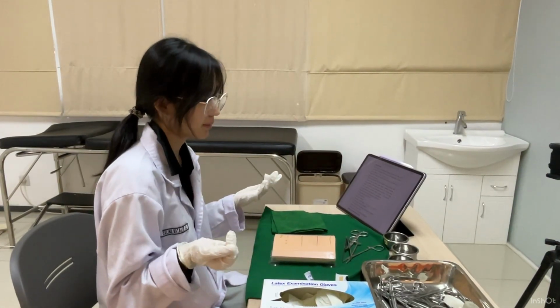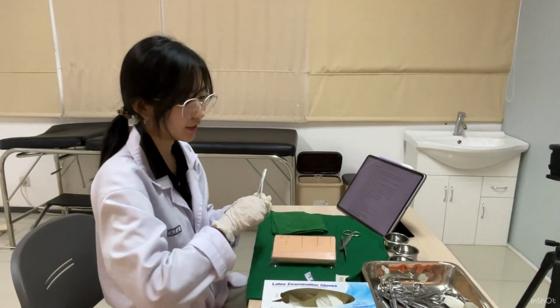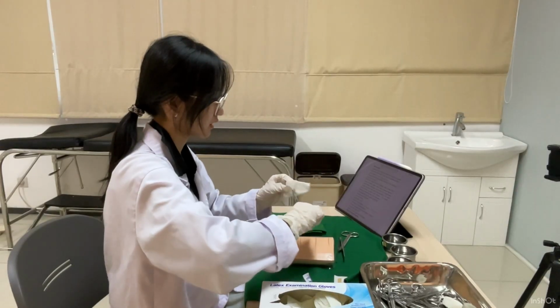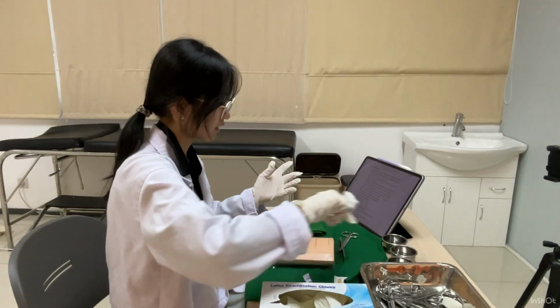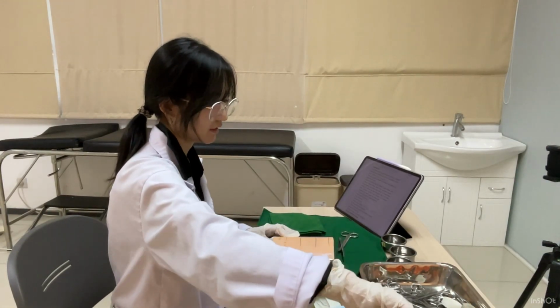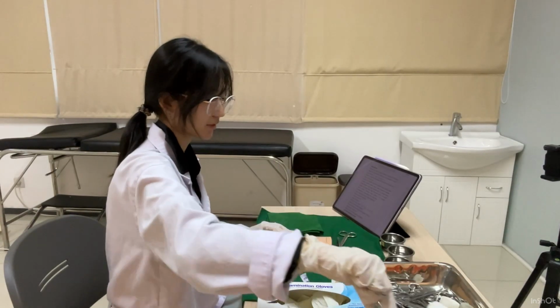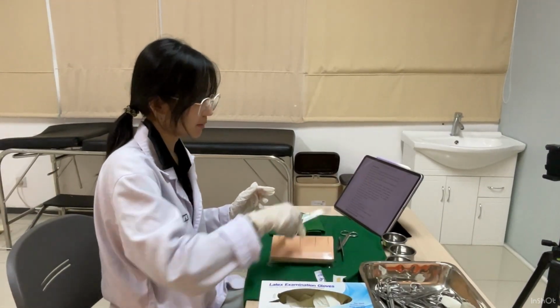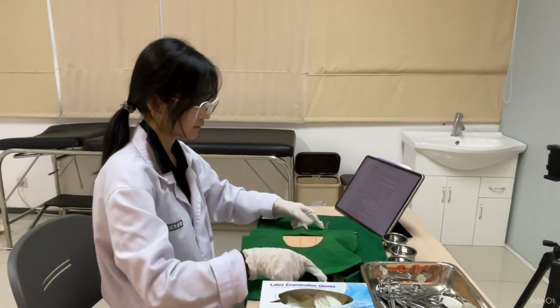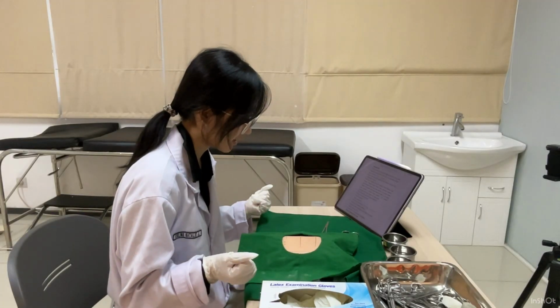And after that, I will perform debridement using the perhydrol, NaCl irrigation, and povidone iodine. So I will use the sterile gauze and dip it in here. And I will perform debridement. Okay, so we're done with that. And next I will apply the sterile surgical cover. Okay, and I will explore the wound to stop any bleeding.